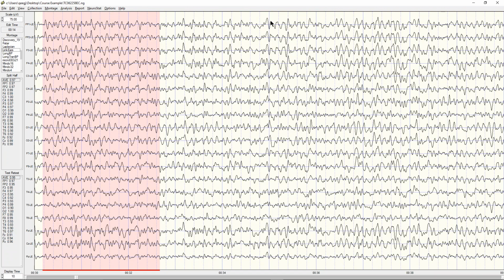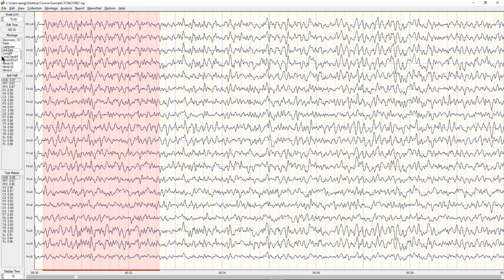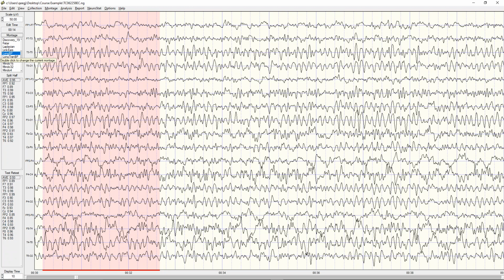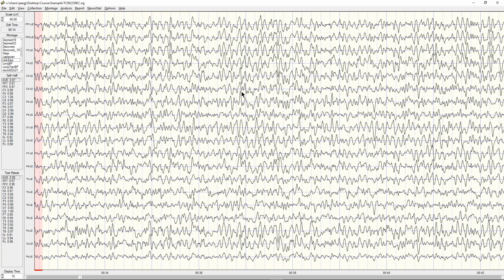This is an evoked potential, probably from a noise or something. She heard a noise and she's got an evoked response. Just some little noise in the environment, and it probably showed up in the temporal lobes, not in the frontal lobes, but because it showed up in the reference, it got contributed to all the sensors.